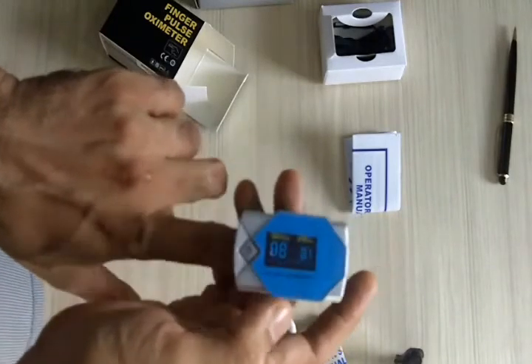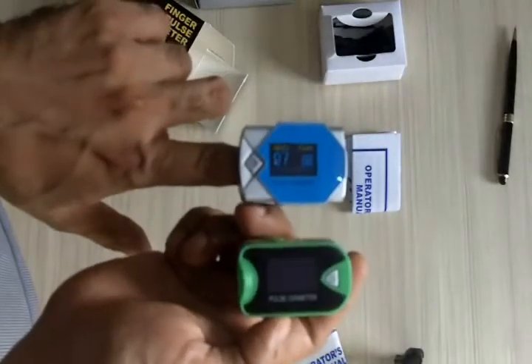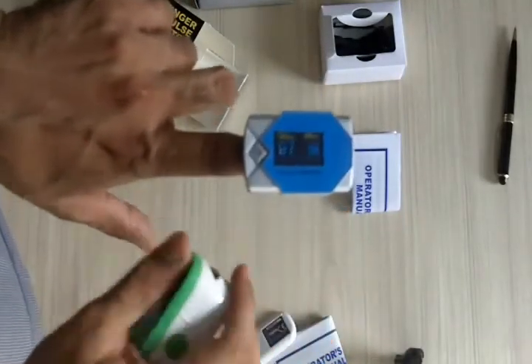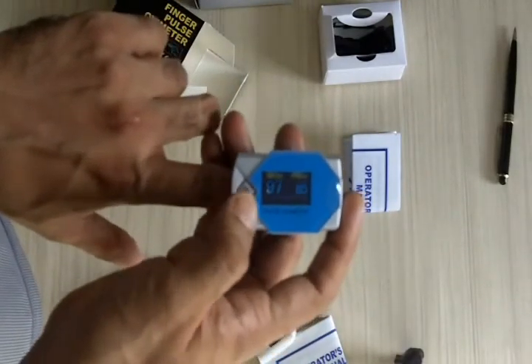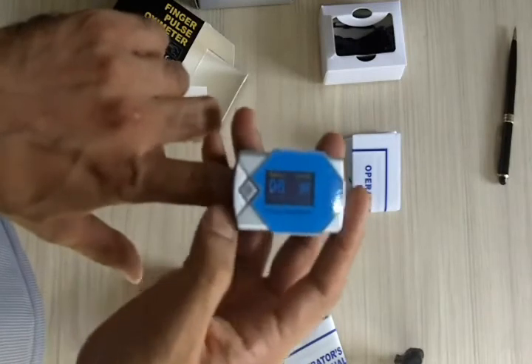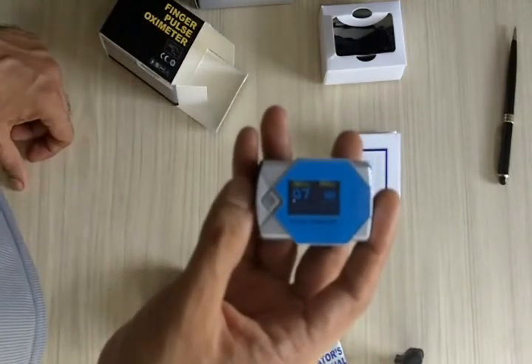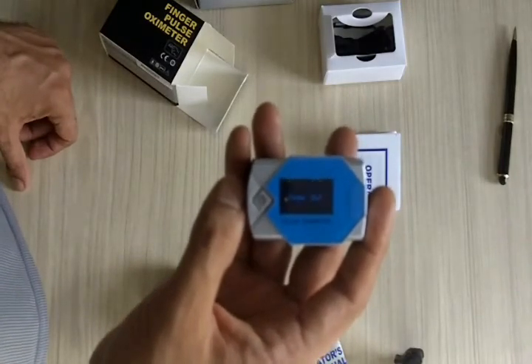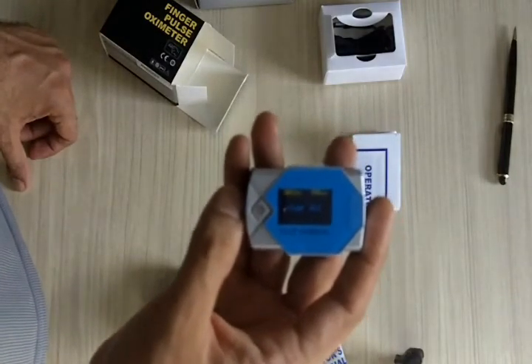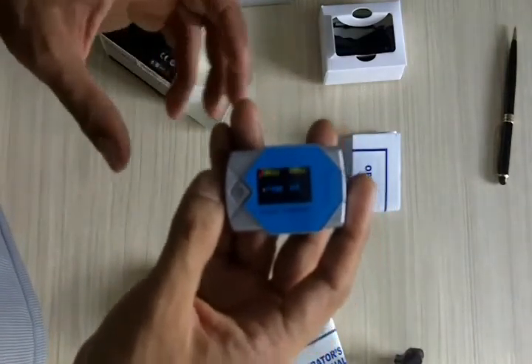So the key difference between this model and the MD 300 C26 is that the MD 300 C3A has audio alarm features. To close, just take off your finger — it will almost immediately detect that the finger is out, and after that it will automatically shut off. Thank you so much.